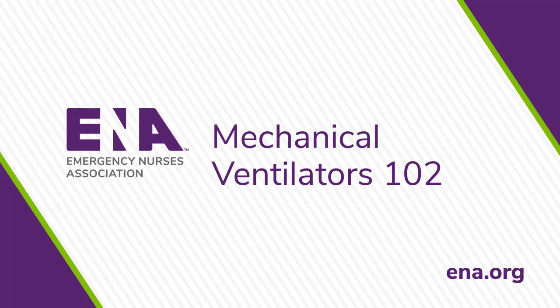The fourth setting is the FiO2, or fraction of inspired oxygen. Simply put, it refers to how much of the air a patient breathes is actually oxygen. Usually, FiO2 is set at 100% at the initiation of mechanical ventilation so that the patient receives maximal amounts of oxygen during the adjustment period and during initial attempts to achieve a stable condition. Again, these are settings established by the physician or advanced practice provider.